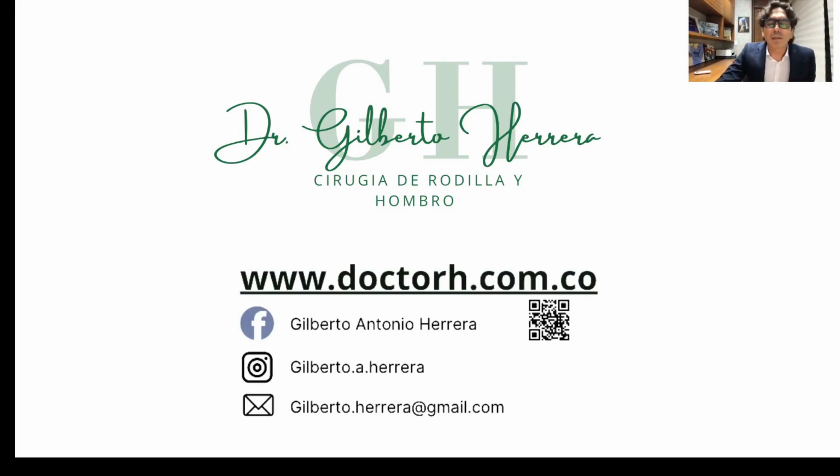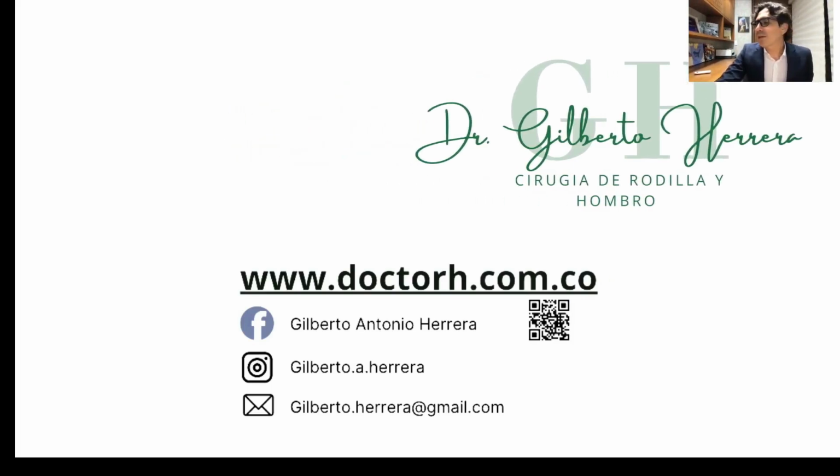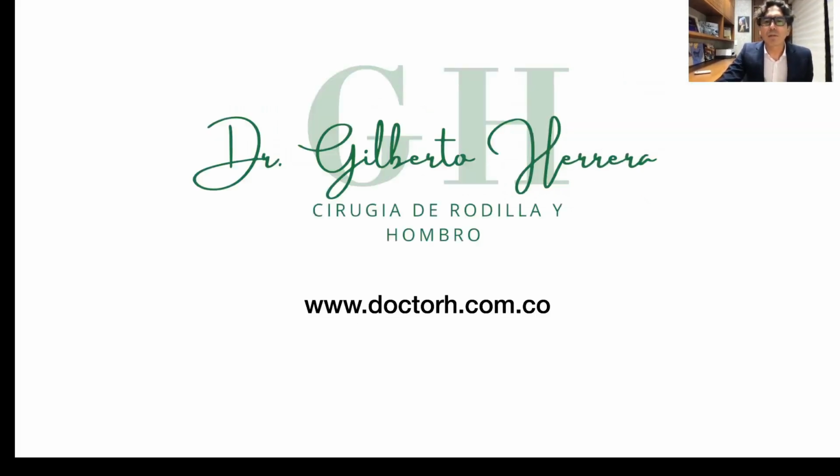With this, we then complete this basic module. We now know how to identify and operate the machine, so we'll consider it finished.